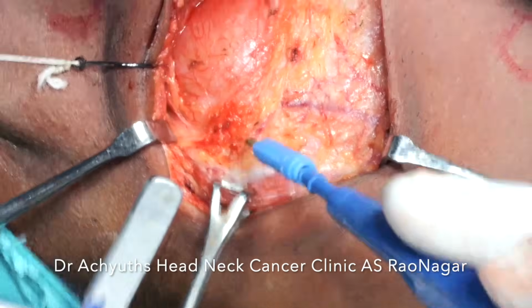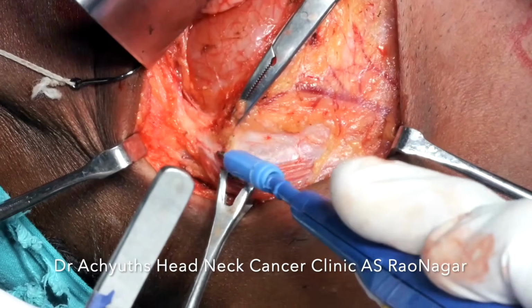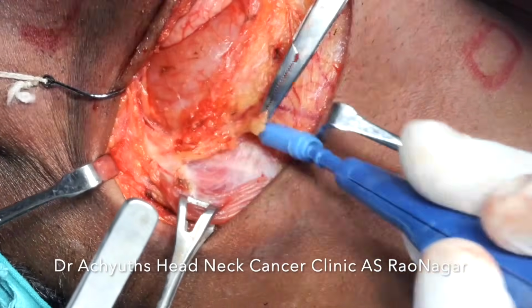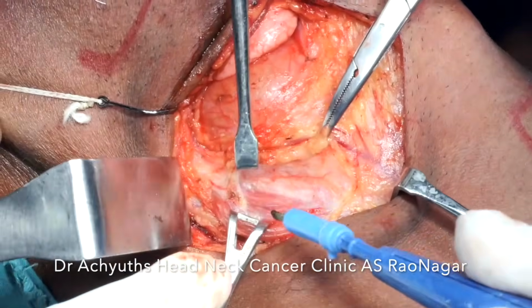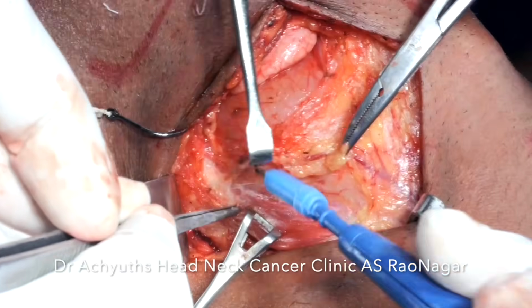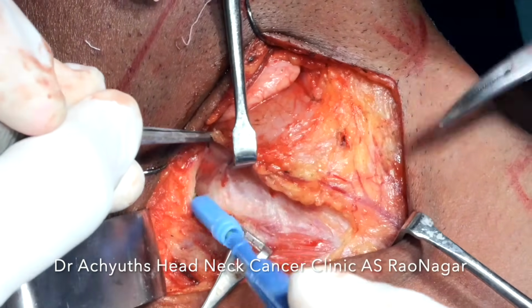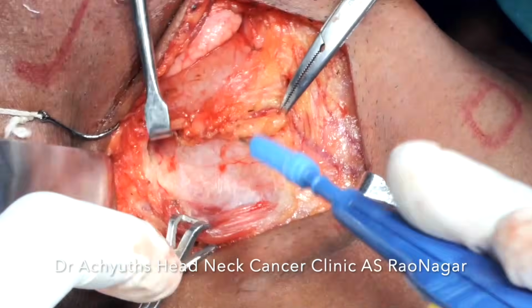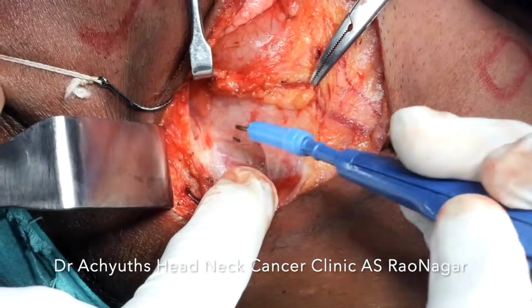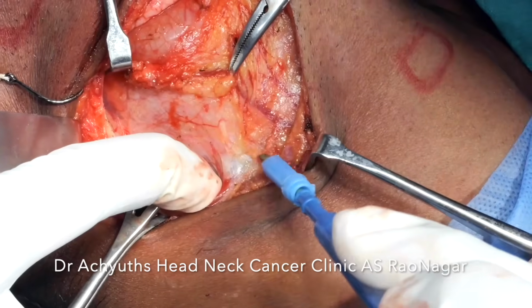The reason why this fascia is maintained and remains attached to the cyst wall is because we cannot hold the cyst wall directly with a Babcock or any other instrument, for fear of breaking the cyst wall. So in order to hold them, to give some traction, we are keeping the fascia over that cyst wall intact, which will help us in mobilizing the cyst.